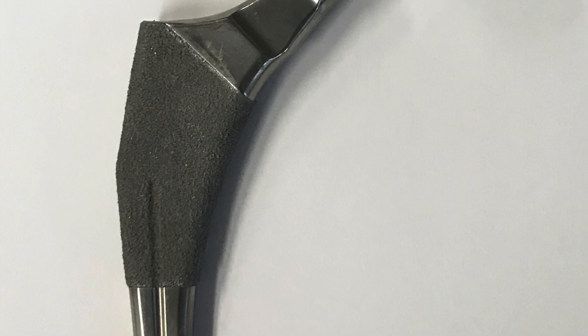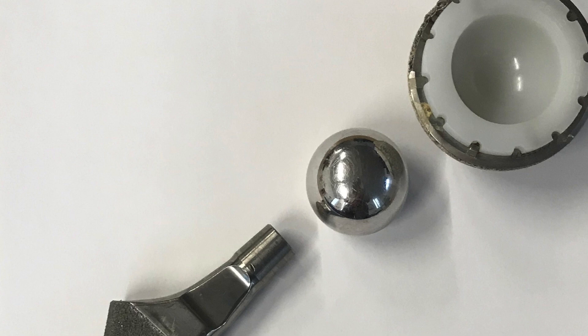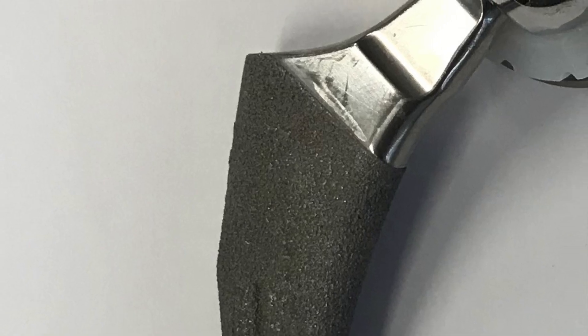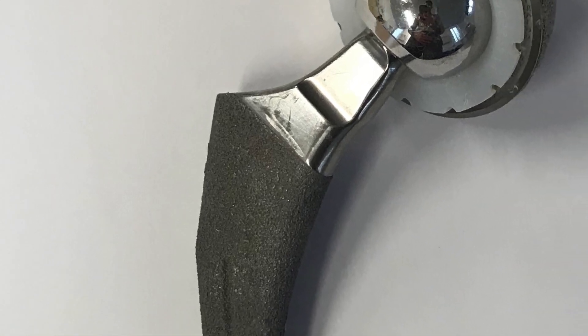Uncemented implants, on the other hand, rely on bone growing onto and into the surface of the components, so importantly the stiffness or bendiness of that material needs to be very similar to bone. For uncemented implants we commonly use a titanium stem with a titanium shell, both of which have roughened or treated surfaces. Bone loves titanium, so if we wedge in the stem and press-fit the cup, then over six to twelve weeks bone will grow onto and into the roughened surface of the titanium implant.